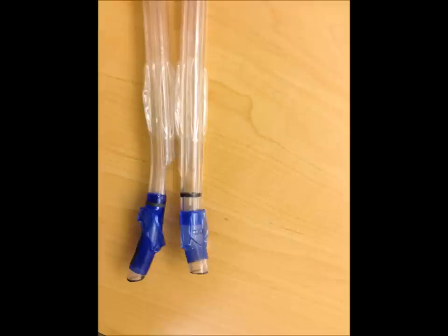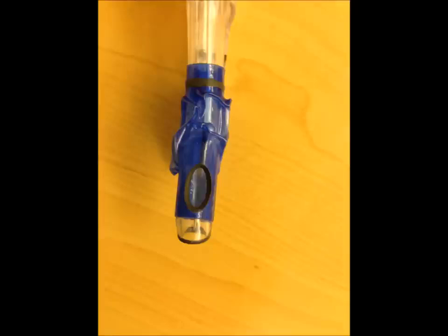Basically, there are two types of endobronchial tubes that we currently use, a right-sided as well as a left-sided endobronchial tube. For all practical purposes, you just need to use a left endobronchial tube. This is what is being taught in the residency programs. Here's a view of the right-sided endobronchial tube. It has a longer cuff and has a Murphy's eye, and because of the short segment of the takeoff of the right upper lobe, if this is not perfectly placed, you're going to have problems with this tube.